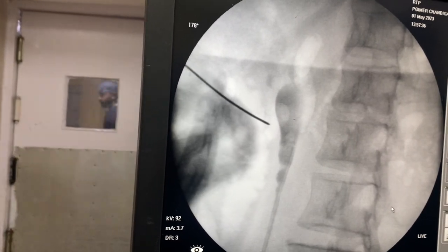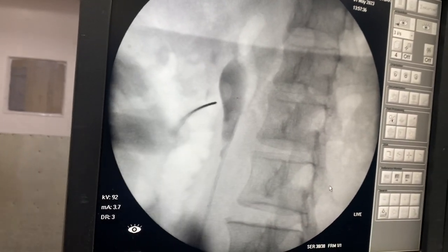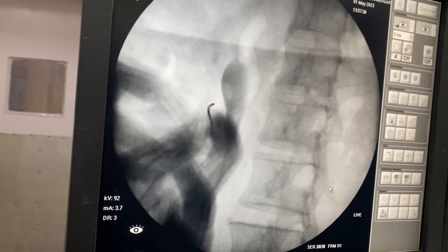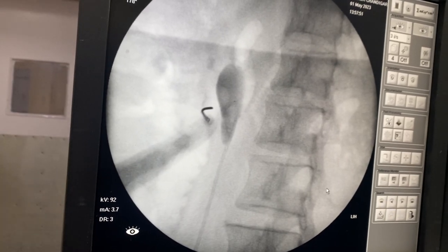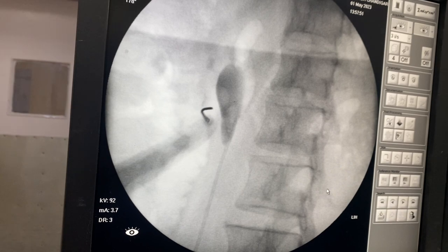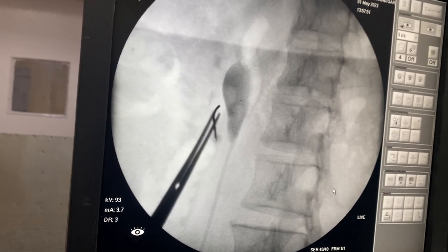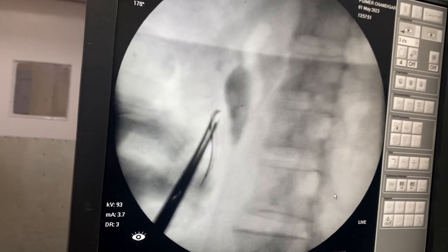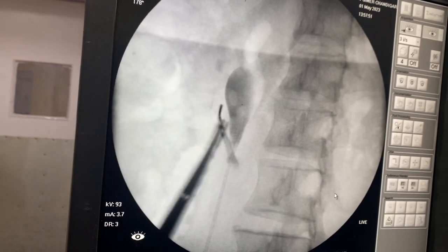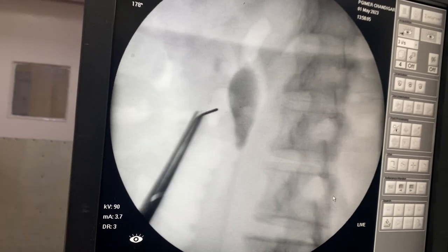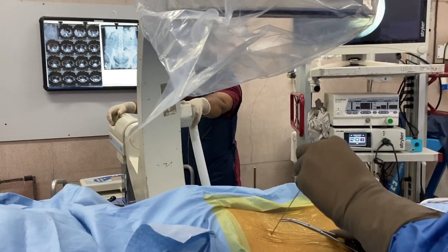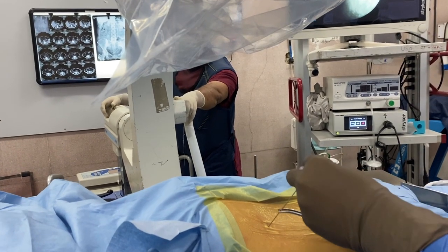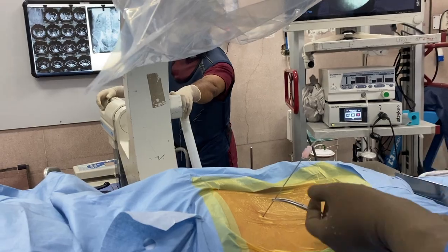You can clearly see the target area. I am now passing the needle into the calyx. Once you enter you get a give-way feeling. Using an artery clamp you can reduce radiation exposure to your hands. You can see the needle has just entered the calyx. In 0 degrees you can see the depth — the needle is actually in the calyx now. Confirm your position by checking whether saline is coming: my assistant is injecting saline from below, and you can see free flow of saline coming out.